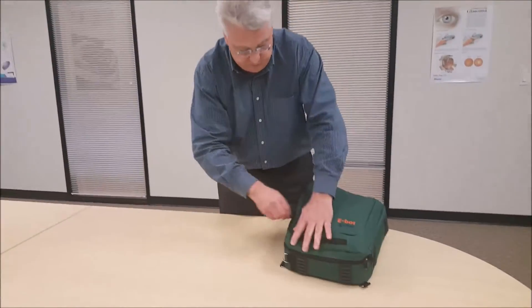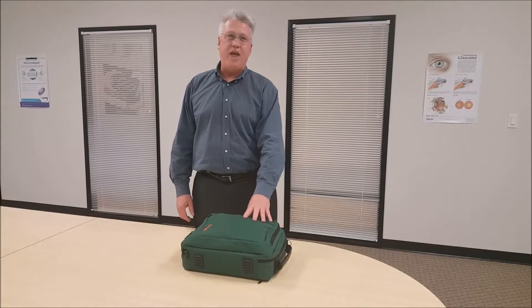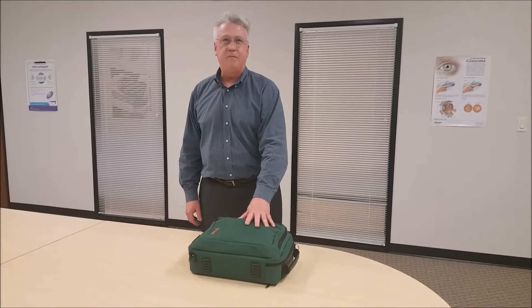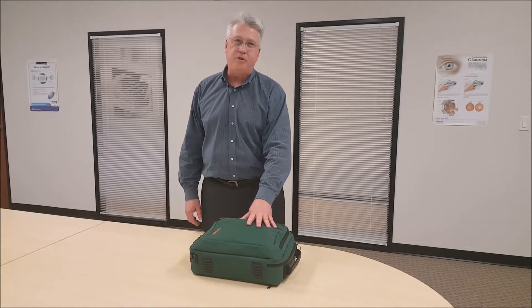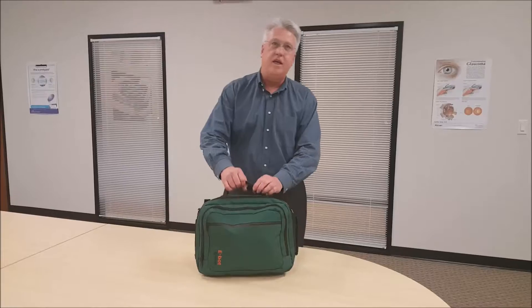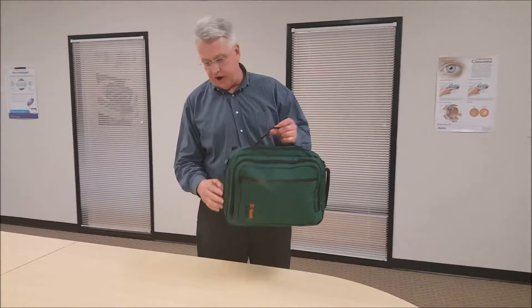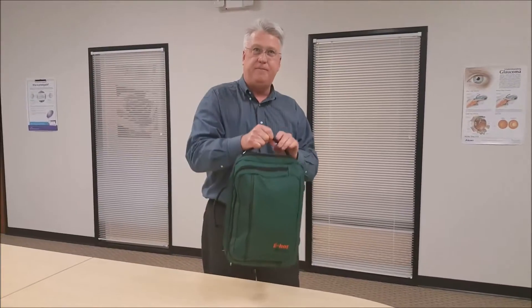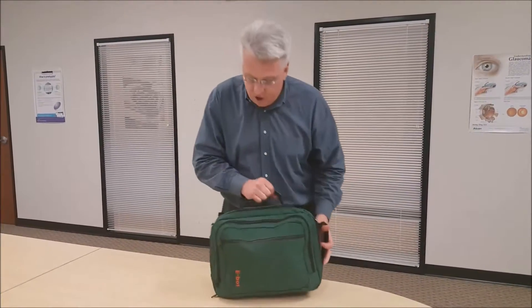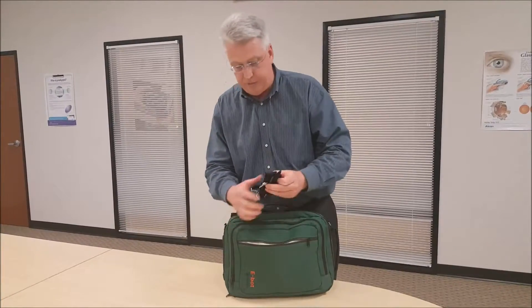Zip that up. Now that the E-Bot is securely stored in the backpack, there are several ways to carry it. The first way is holding it horizontally, and you can also carry it vertically. You can also attach a shoulder strap to it.